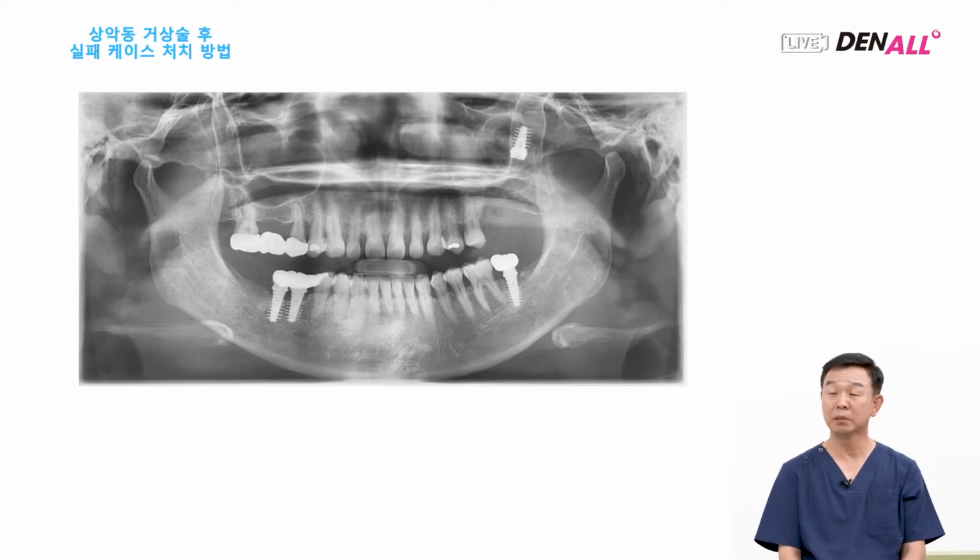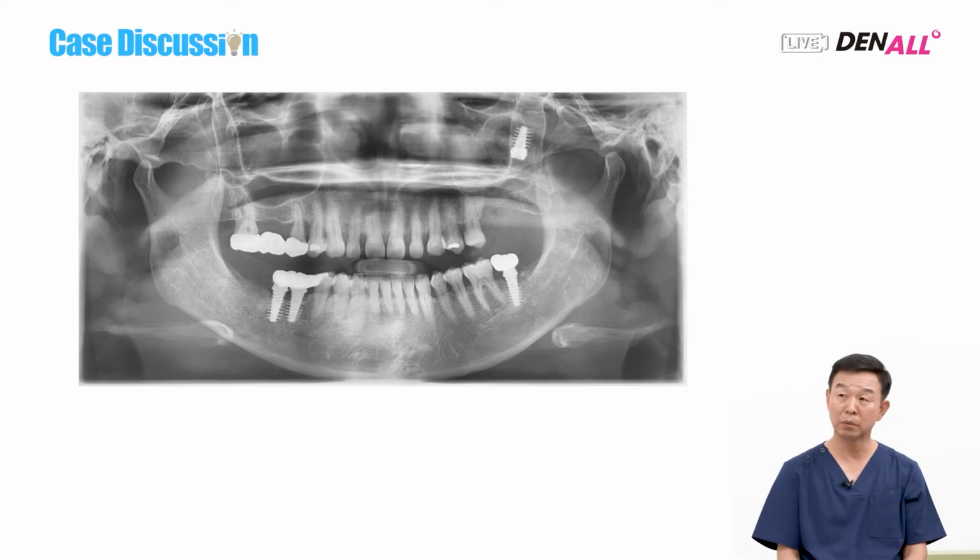When an implant is in the sinus, the most basic principle is to remove it as soon as possible because it can be removed more easily. If the patient is lost to follow up or if you're not confident in doing the procedure, as time passes the implant will be surrounded by granulation tissue and it is difficult to detect, and it will be very challenging to remove it through the lateral window approach. Whatever the technique may be, the first priority is to remove the implant.